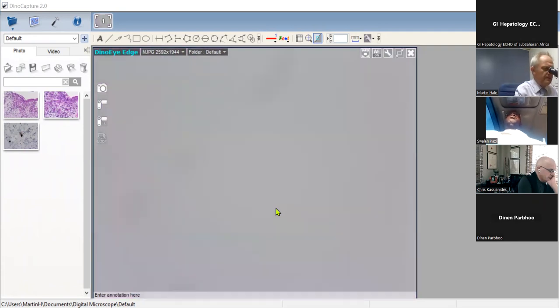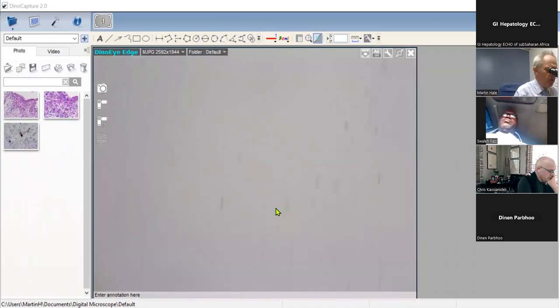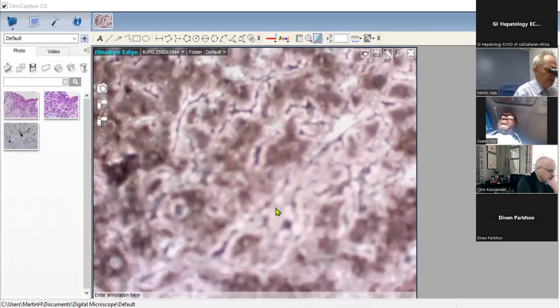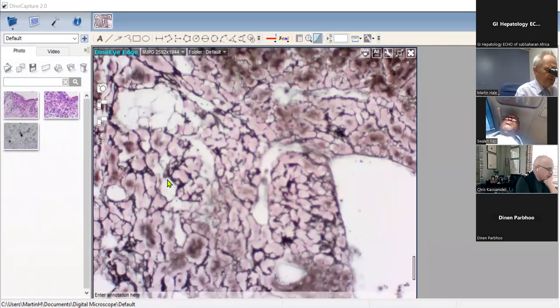And this is the reticulin stain. The physician concerned, I said, this is an HCC. I did it before I received the specials. And one of the features of hepatocellular carcinoma is that there's a marked paucity of reticulin. And if we look here, we can see these reticulin fibers. They are fragmented and they're relatively sparse, but nevertheless, they are there. And this was of a bit of a concern because usually you in fact want to see an absence or a complete absence of reticulin.